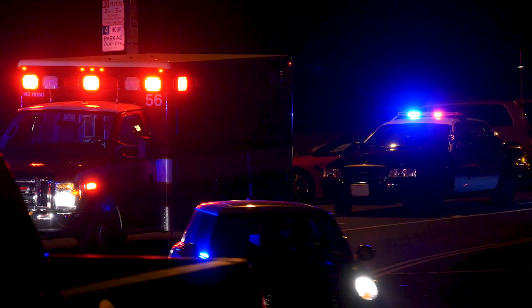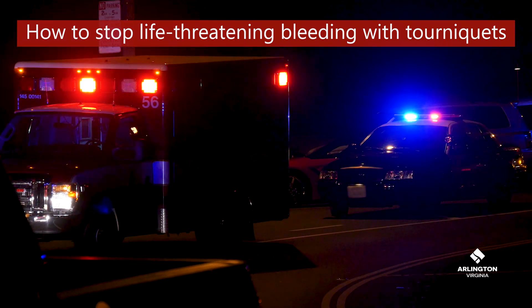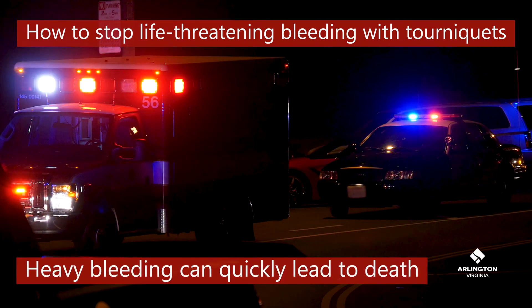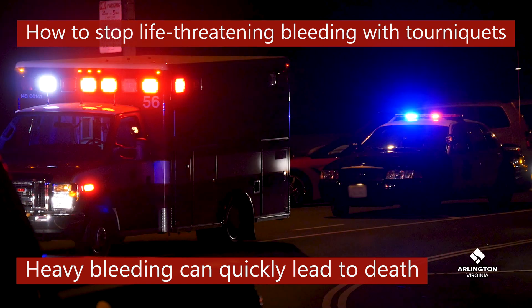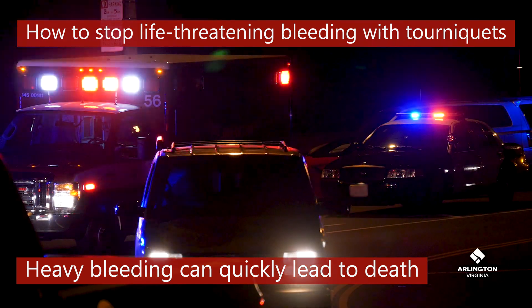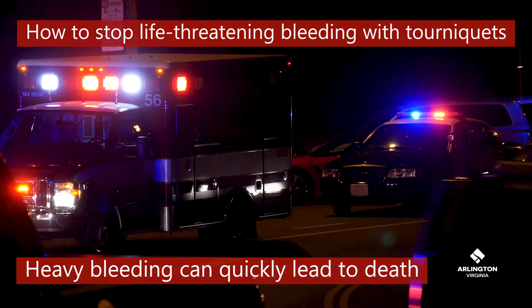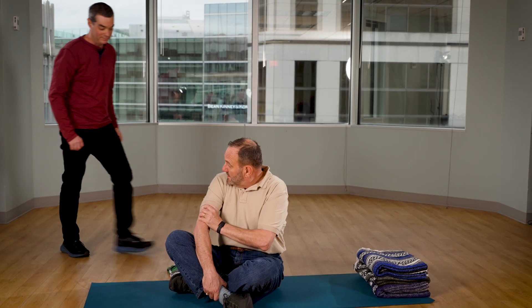In this video we will show you how to stop life-threatening bleeding with tourniquets. Stopping heavy bleeding from arms and legs is your highest priority because it can quickly lead to death. Tourniquets are a safe, effective, and fast way to control heavy bleeding. Commercial tourniquets are faster and more effective, but we will also show you how to improvise a tourniquet.